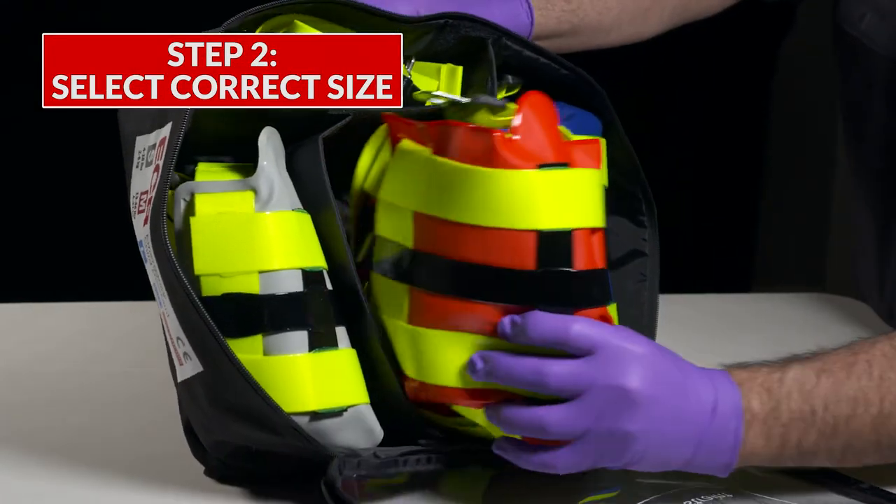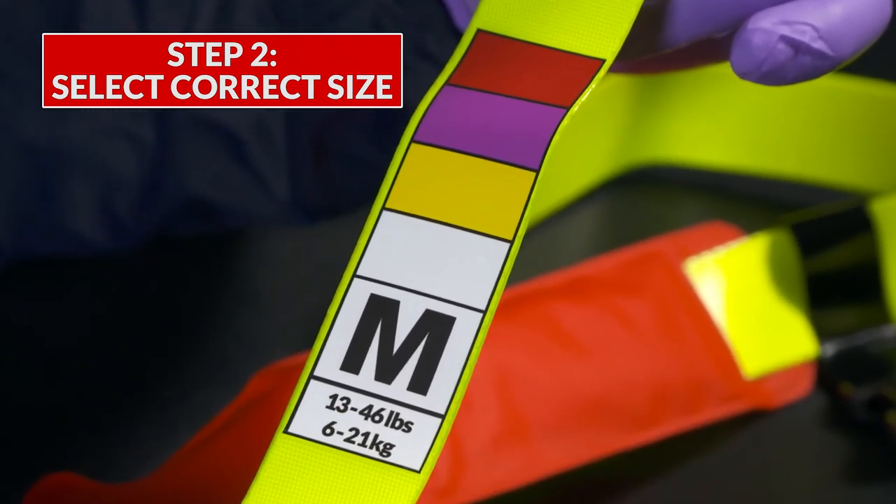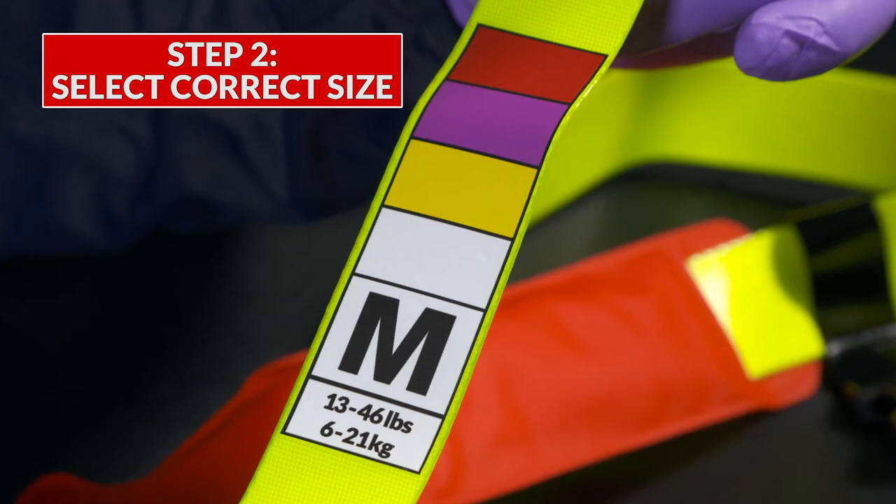Select the correct sized harness. The Braslow color codes along with the harness size and patient weight range can be found on the harness and on the harness shoulder straps.